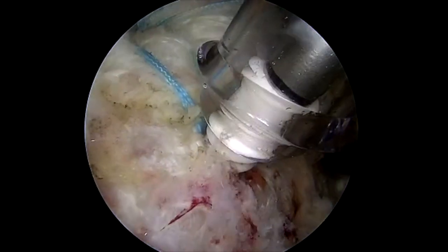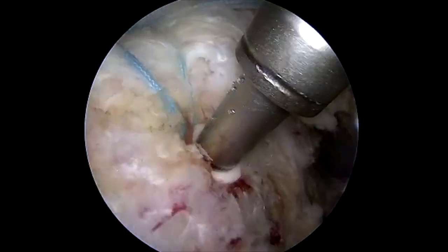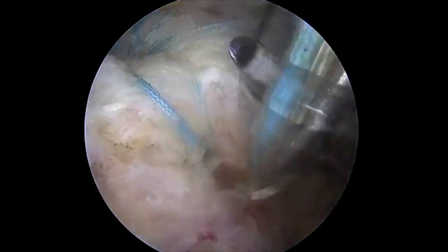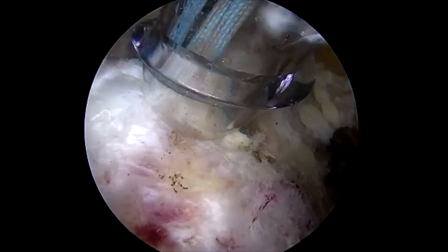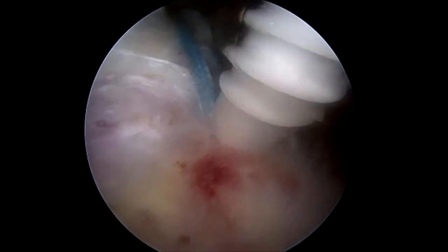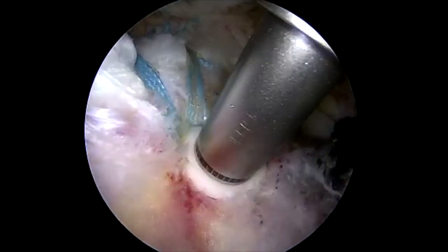Appropriate tension is applied on the tape and the anchor is deployed. The threads in the more proximal portion of the anchor are then engaged with the most lateral aspect of the cortex. The tapes are cut. The remaining two permatape are removed from the portal, incorporated into an anchor, and the anchor inserted into the more posterior portion of the greater tuberosity.